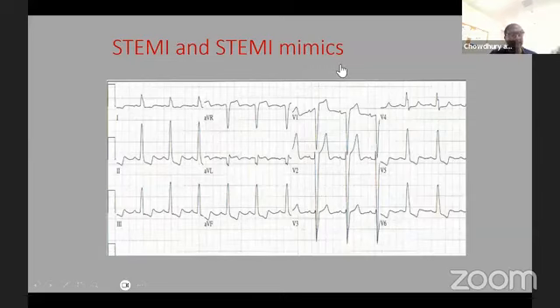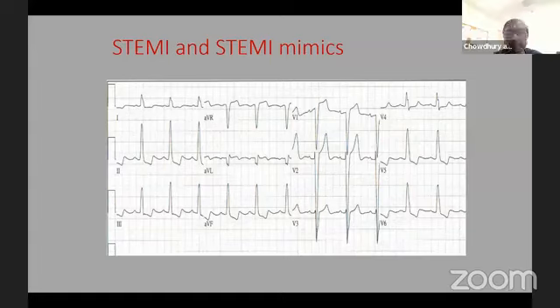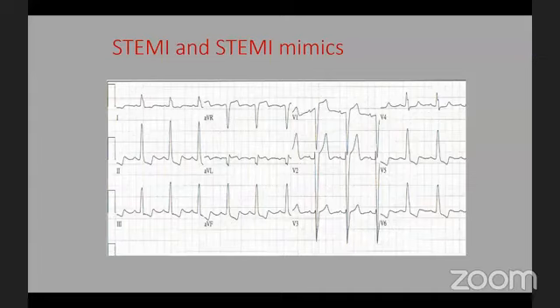Very good question. So let me walk you through. If the troponin comes in, and if this is left bundle and ST elevations, new left bundle, because you don't know the previous EKG, what will the infarct related artery be? Definitely highly LAD. LAD, Sir, and it is usually proximal LAD, correct? Proximal LAD, you can do a bedside echo, and then you can look at the clinical context.